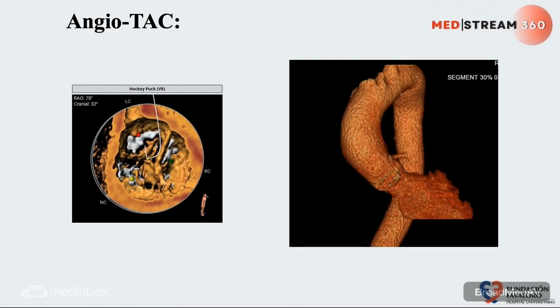If you want to comment, we have some calcium, but not too much. Not too much. So a very important comment for balloon expandable valves is to have a very accurate measurement of the size, probably more important than self-expanding technologies. And second, in this case, without too much calcium, better to have a good size, because we don't want the valve to embolize.